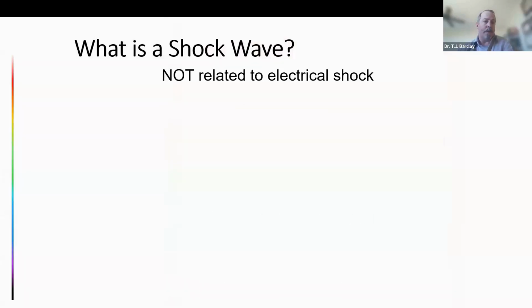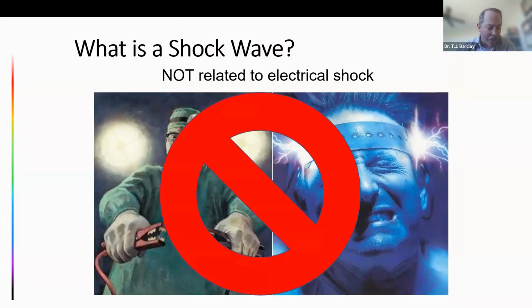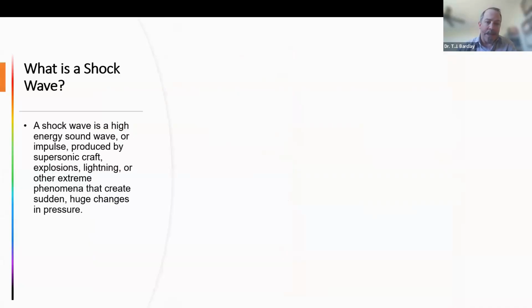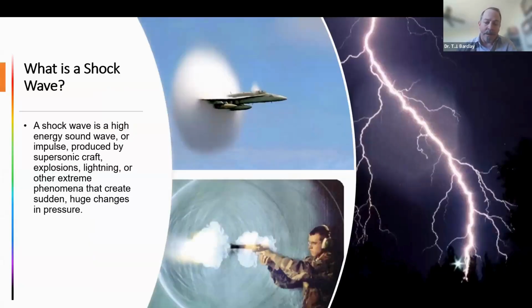So, I want to dispel any misconceptions here. Shockwave has absolutely nothing to do with electric shock. What a shockwave is, is a high intensity sound wave, and some other things that you're probably familiar with are also shock waves: the sound from a gunshot or a jet breaking the sound barrier. Those are also examples of shock waves.